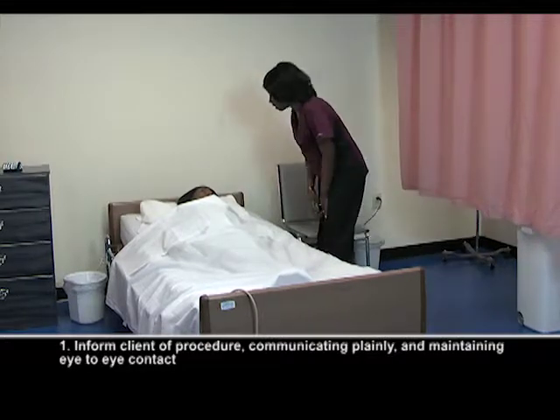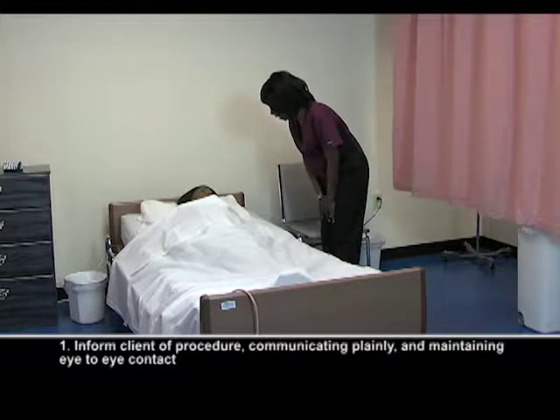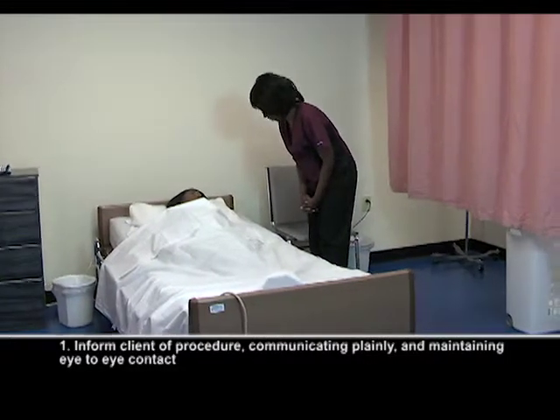Hello, Ms. Smith. It's Kathleen. The nurse asked me to come in and get your weight, okay? We're going to get started with that procedure in just a moment.